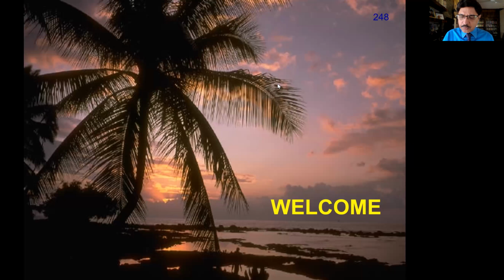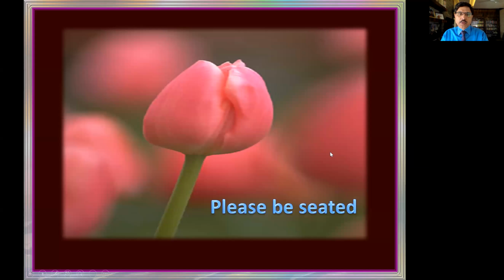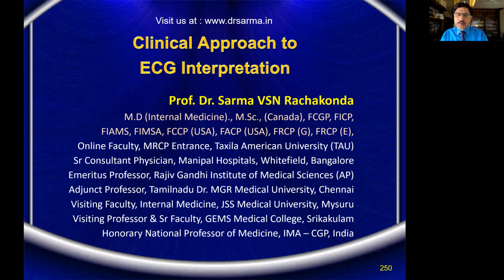Okay, so welcome back to the workshop on ECG, and we are going to look today at the continuation of the discussion on various arrhythmias. As you have already seen earlier, we have looked at the clinical correlation of some of the arrhythmias. Particularly, we understood 3 or 4 important things.